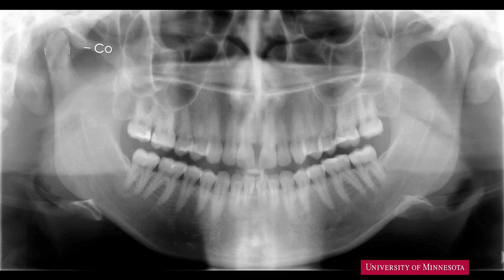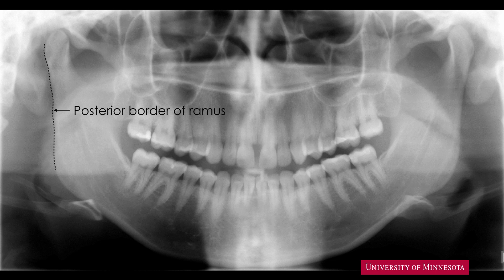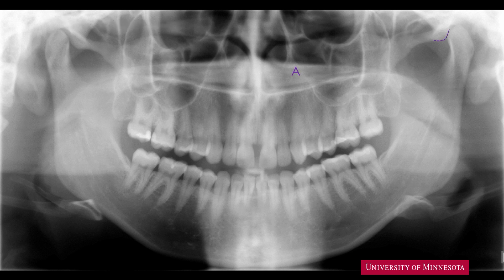On the superior part is the right condylar head. On many panoramic images, the superior border of the condyle may be obscured by other superimposing bony structures. After we identify the condylar head, we can see the posterior border of the right ramus. Superior to the condylar head, we can see the articular fossa. The bony protrusion is the articular eminence. On the mesial part of the condyle, we have a bony depression called the sigmoid notch.